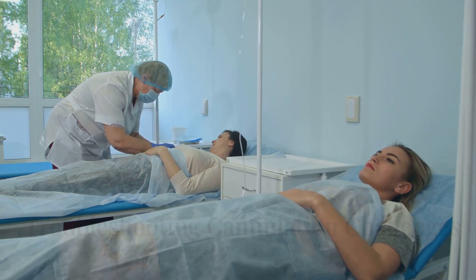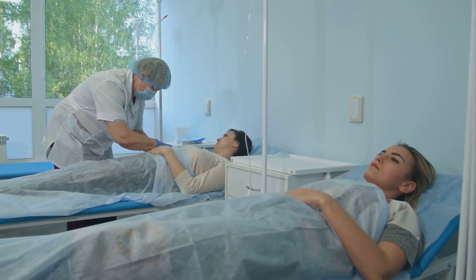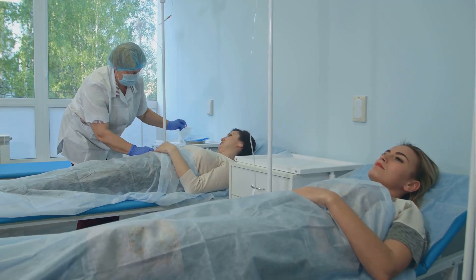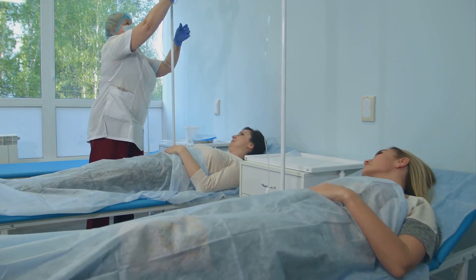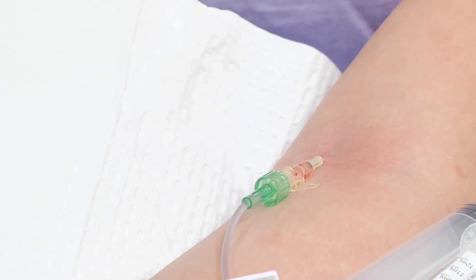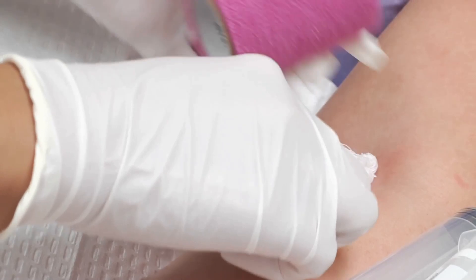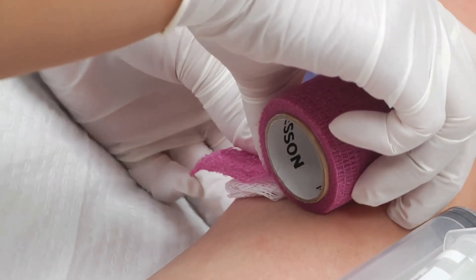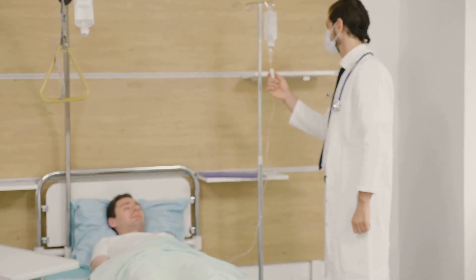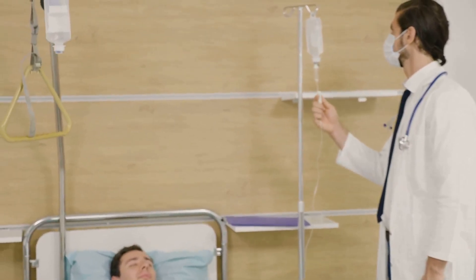Even with the best technique and plenty of practice, cannulation isn't always smooth sailing. Sometimes, unexpected challenges can arise, even for experienced healthcare professionals. You might encounter problems such as a blocked cannula, infiltration or phlebitis. These complications can happen at any time during the procedure or while the IV is in place. Don't panic. Staying calm and methodical is key.